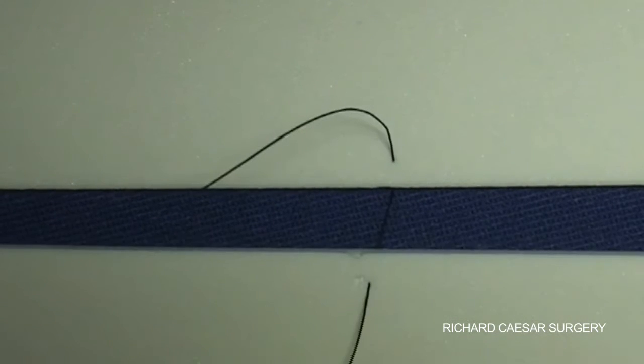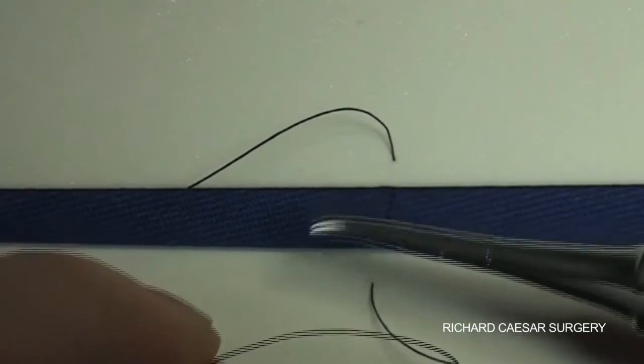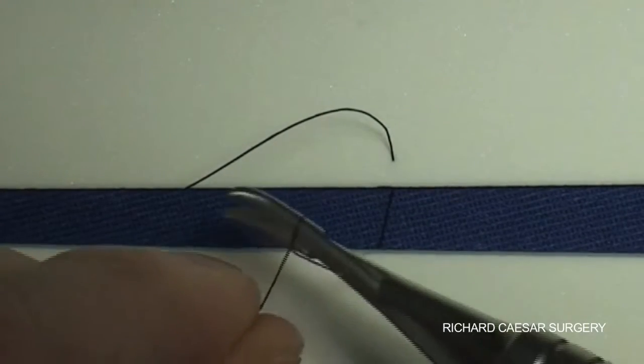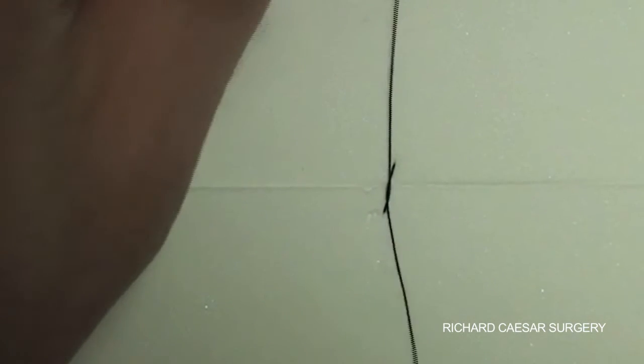Here I'm using some toy foam or modelling foam as my material, and I've picked up a stray 5-0 silk, and I'm demonstrating an interrupted suture.